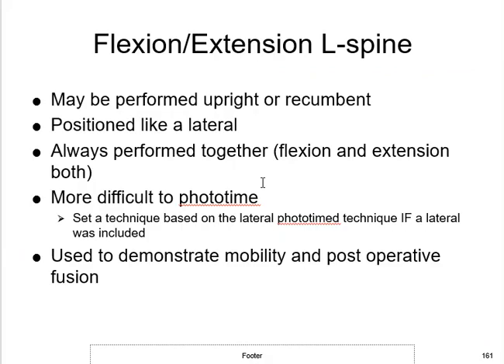So flexion and extension can be performed upright or recumbent, as can the bending. But our flexion and extension is always going to be performed together. It's always going to be a lateral. The bending is going to be AP. It's going to be pretty difficult to phototime.